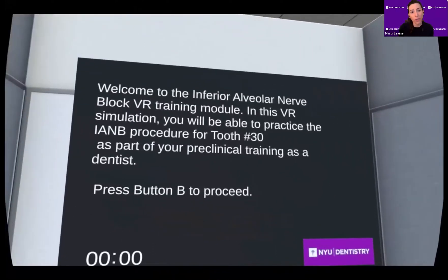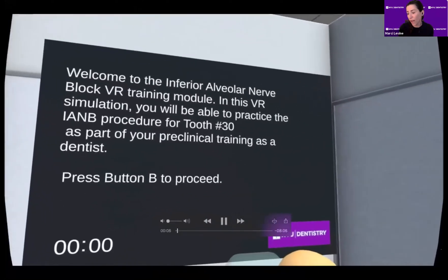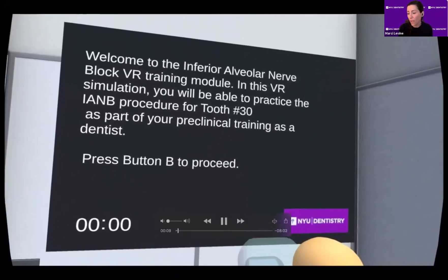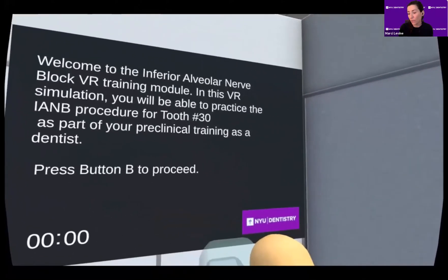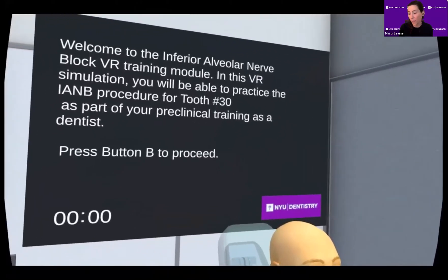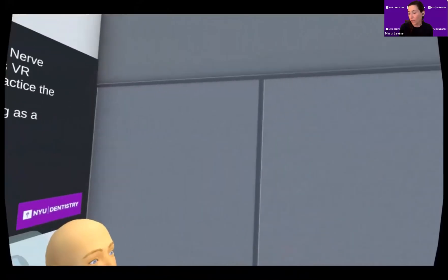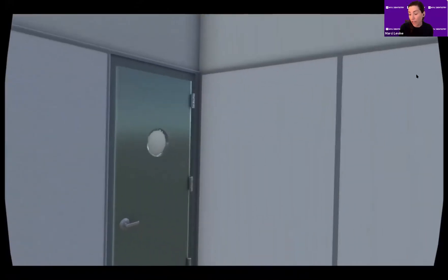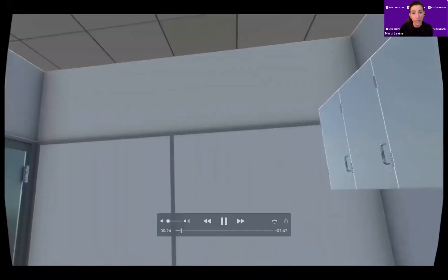This video capture is a two-dimensional rendering of an experience that is truly 3D. The goal of this module is to allow students to practice an inferior alveolar nerve block. I will be narrating each step of this virtual exercise, and after the student completes each step, I will pause my narration until the student begins the next one.